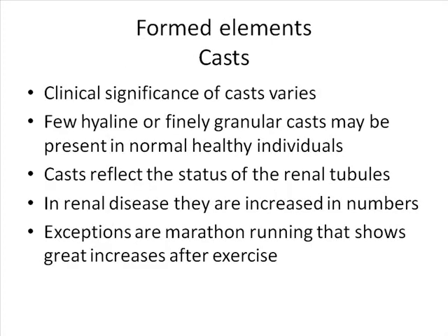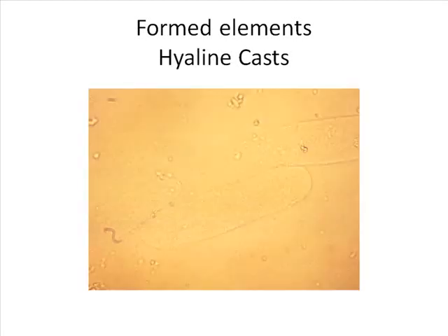Now, clinical significance of casts varies from problem to problem. Hyaline, finely granular casts are very normal. Those are the ones you're going to see when the guys go out and exercise and put stress on the kidney. They are very light, and remember, the first time that you saw a cast, you're like, oh, now I see.